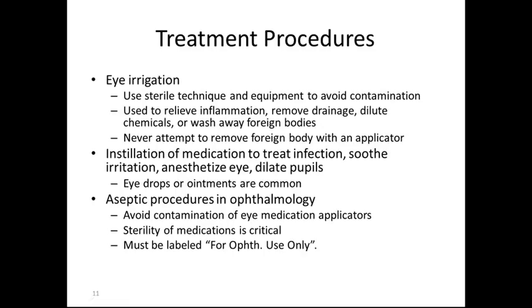Treatment procedures of the eye. Eye irrigation. Use sterile technique and equipment to avoid contamination. It is used to relieve inflammation, remove drainage, dilute chemicals, and wash away foreign bodies. Never attempt to remove the foreign body with an applicator or tweezers.